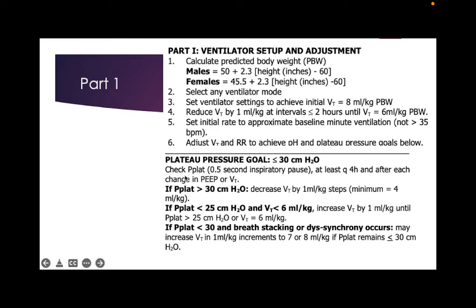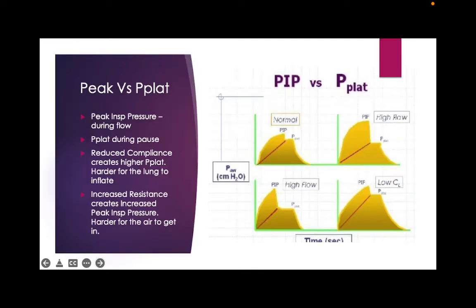So let's talk about pressure. We talk about peak pressure, peak inspiratory pressure. If you look at your pressure waveform on your vent, it normally, on volume control, goes to a point, okay? And that top of the point is your peak pressure. That is how much pressure it is getting to get to the lungs. If it's got to squeeze through parts of the lungs and get in there, it's going to be higher pressures, right? Then we can make that air stop and do something called a plateau. And we can see how much pressure it takes to hold the air in there.